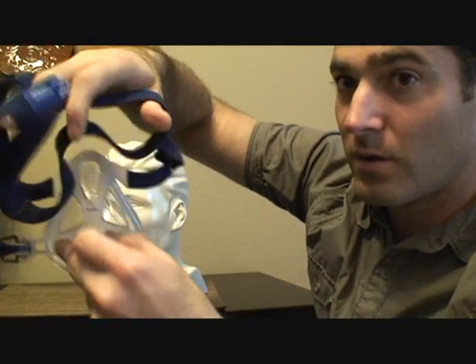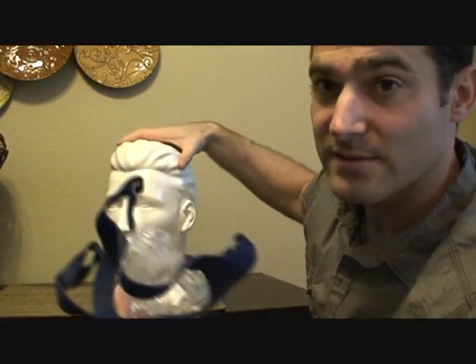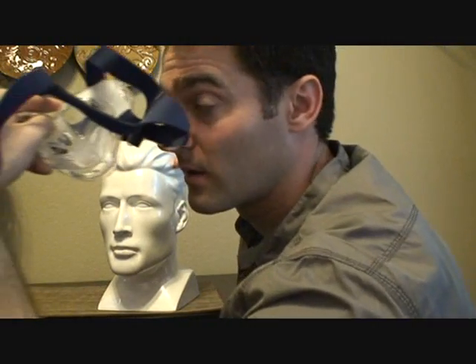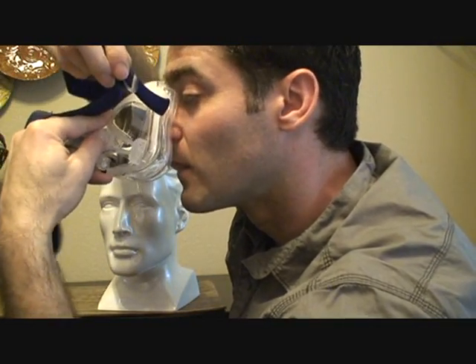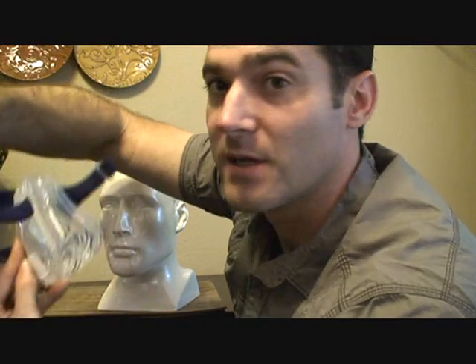Whatever side you're comfortable with, hold it like this. With this mask it's very important that you want to put this on your nose first and then bring it down to cover your face. That way it gets a good pinch on your nose, hopefully making it less prone to leaking — that's somewhat important with this mask.